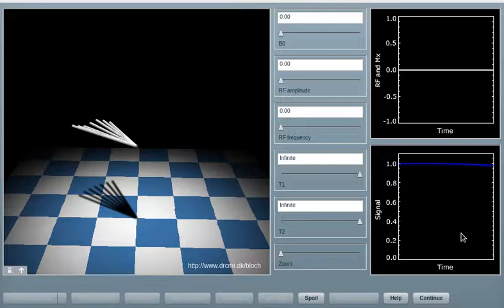Now there's another type of transverse relaxation that is not reversible, and that is T2. Now every tissue has its own T2, and the T2 is dependent on, well, it's dependent on several things, but one is the interaction between the protons themselves. Okay, and that is not reversible because it happens in a random way, and not in a predictable way.